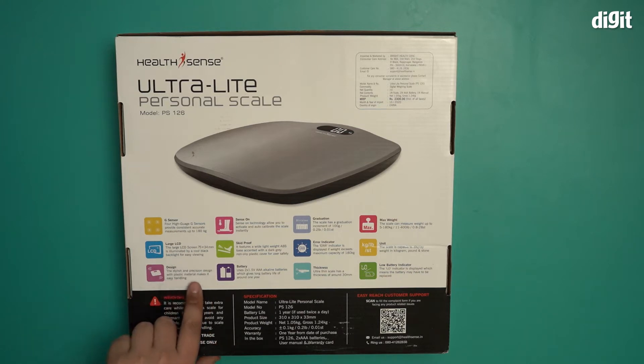The design is stylish with plastic material, making it easy to handle. It has Sense-on technology which allows you to activate and auto-calibrate the scale instantly. It's also skid-proof — it features a wide, lightweight ABS base accented with a dark gray non-slip plastic cover for user safety.